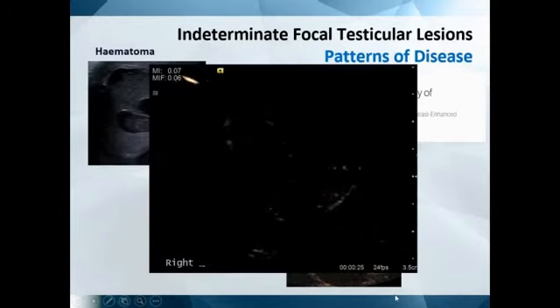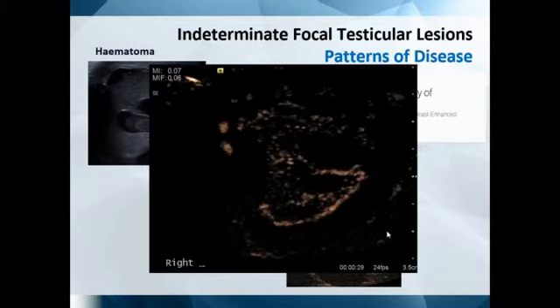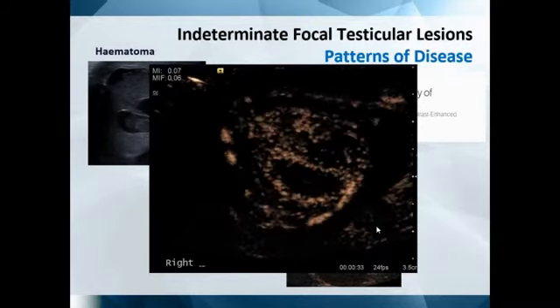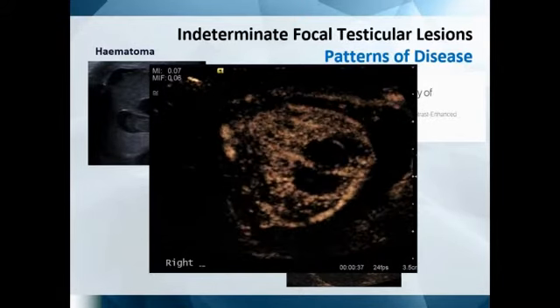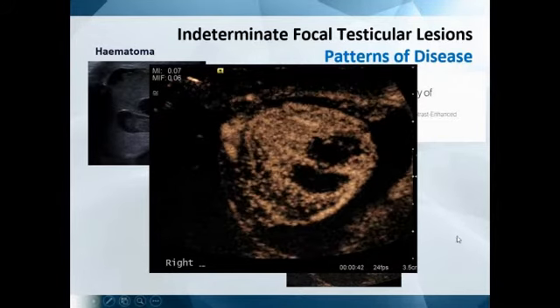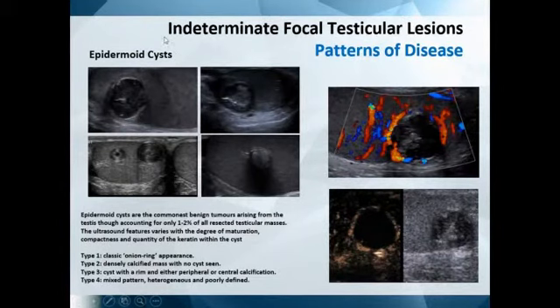And if we look at the video clip of this, you'll see that again, because it's not so inflamed, the contrast enhancement is not so florid as it was in the inflamed testes, but there's clear demarcation of these areas as being non-vascular. These are hematomas. Your management is different.